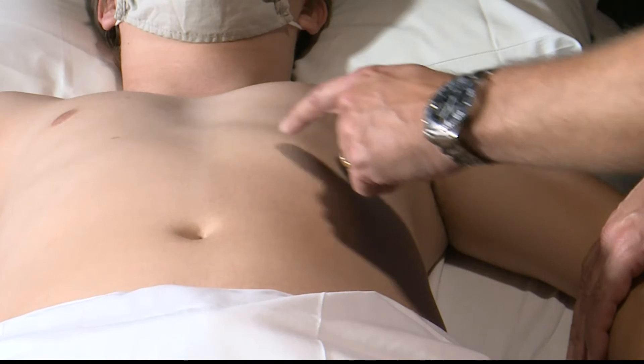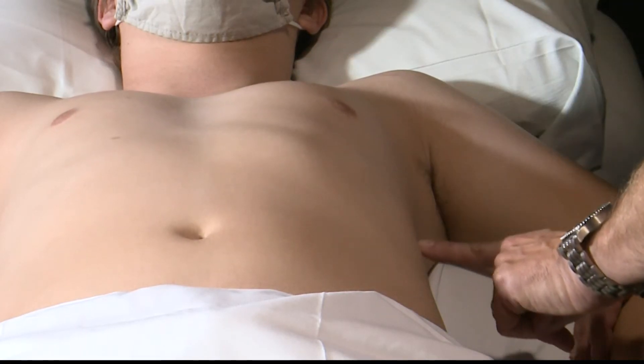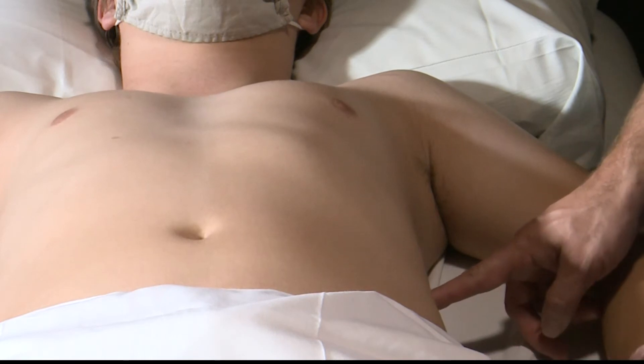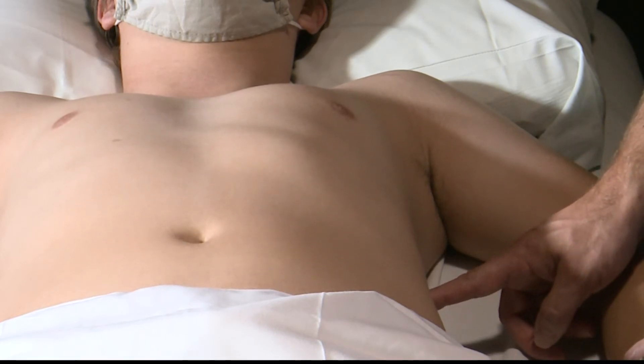For the left upper quadrant view, we're going to be imaging around the spleen. To find this view, we're going to draw an imaginary line from the xiphoid process all the way over to the posterior axillary line. Where these two lines intersect, we're going to place the probe for our perisplenic, or left upper quadrant, view.